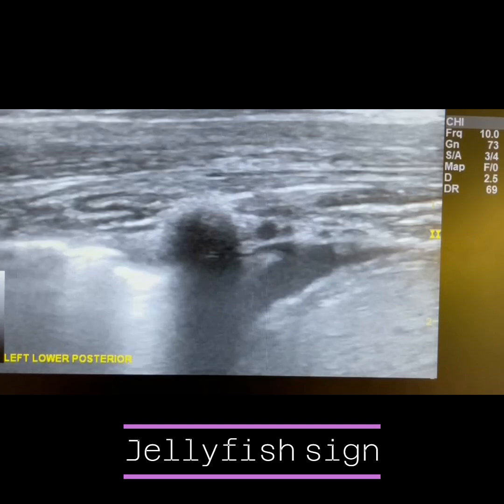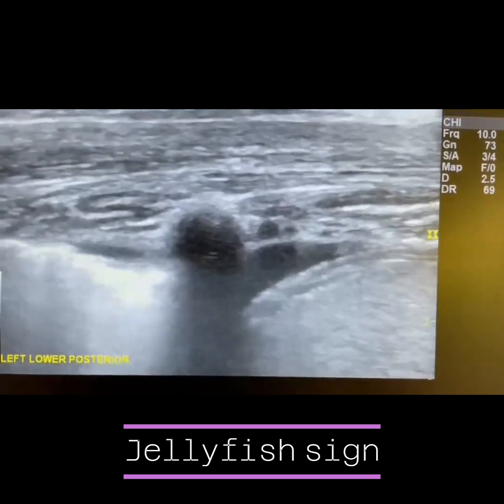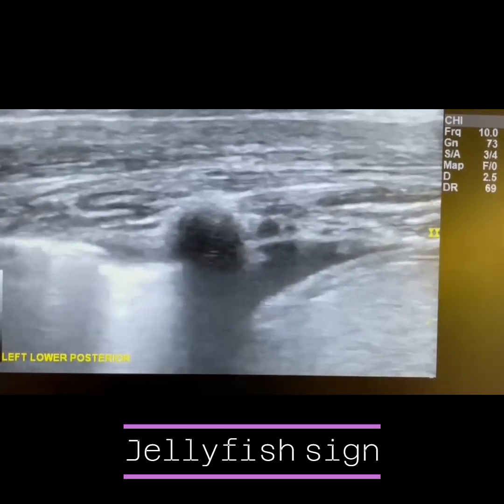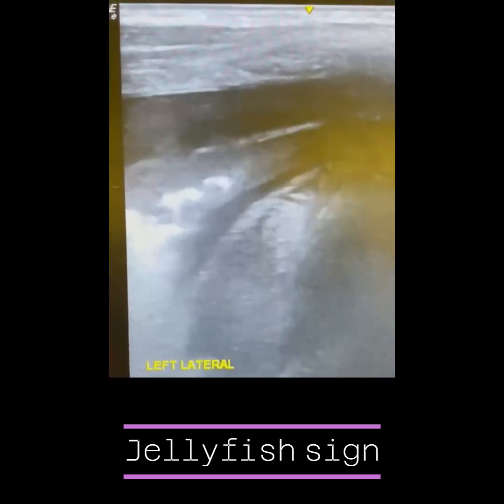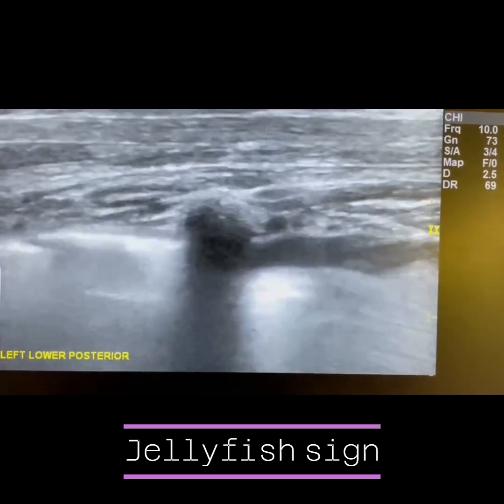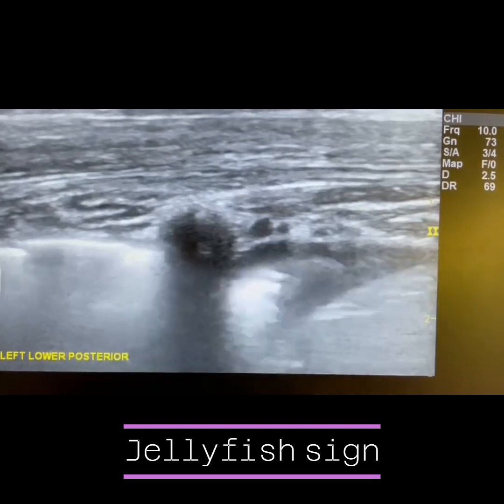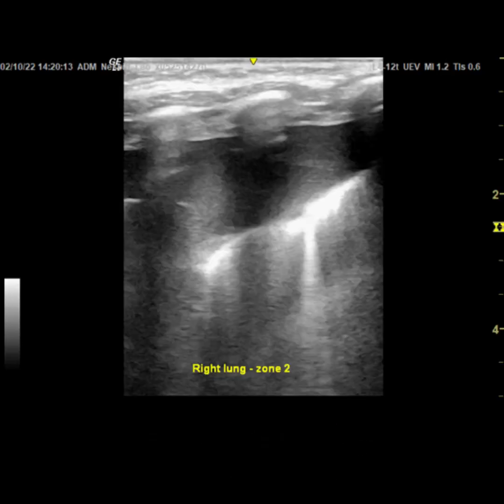So typically what we're seeing is the residual solid lung flapping around in this large effusion, and presumably the pressure in and around the pleural space caused by the effusion leads to such a significant collapse, reducing the residual lung to just a small flap. Hopefully this is something you would all recognize and appreciate the significance of.